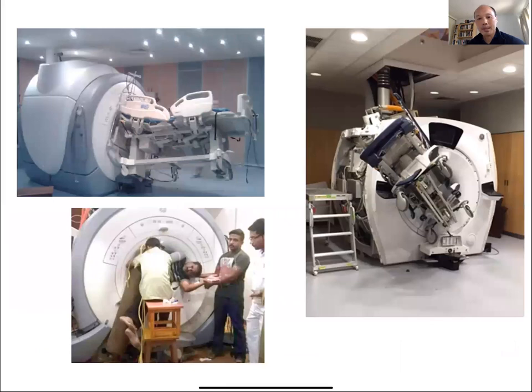As you saw from the safety video, this is a very strong magnetic field, and it should not be underestimated. These two pictures are pictures of gurneys being sucked into the magnet. And this one, unfortunately, is a person who actually got trapped. I think he survived, but he did have some injuries.